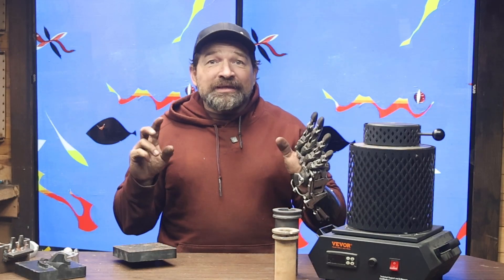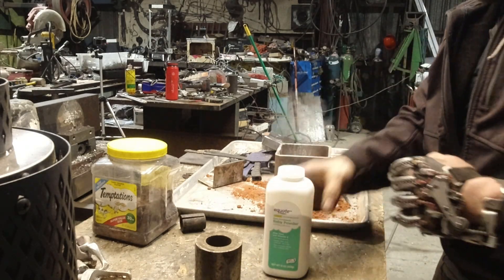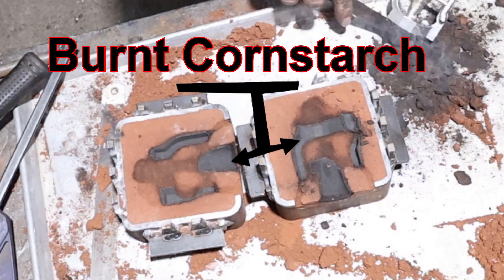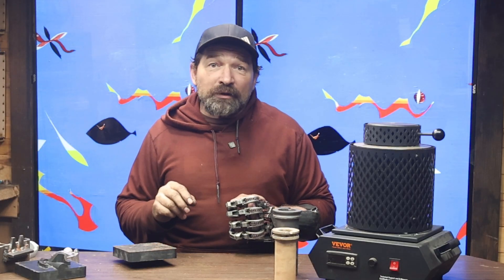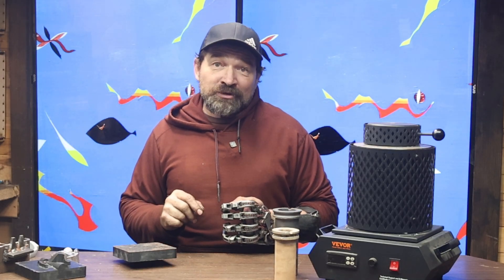Another thing I figured out is using cornstarch-based baby powder works pretty well as a release. It ends up burning off without causing too many issues. Real-life talcum or mica powder does work better, but over the last couple of years it has become super hard to source outside of special ordering it from Amazon. It seems everybody has lost their mind over talc potentially containing trace amounts of asbestos.